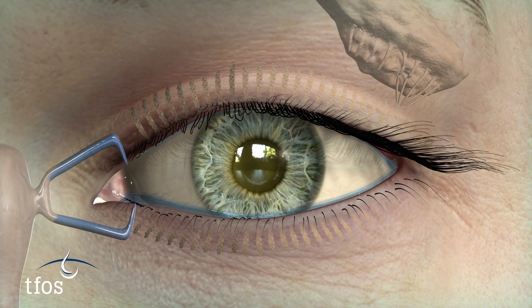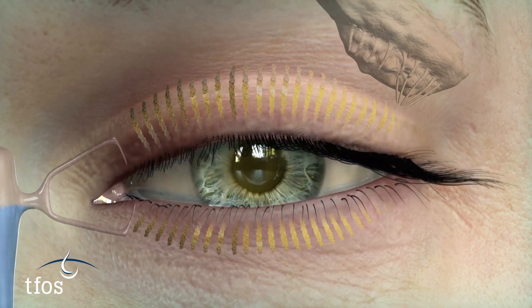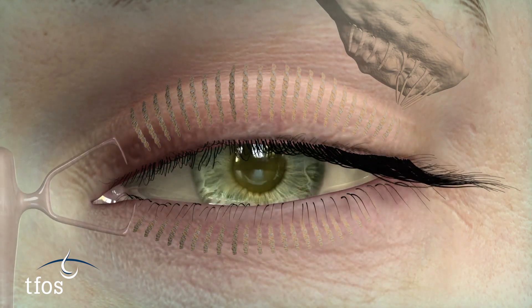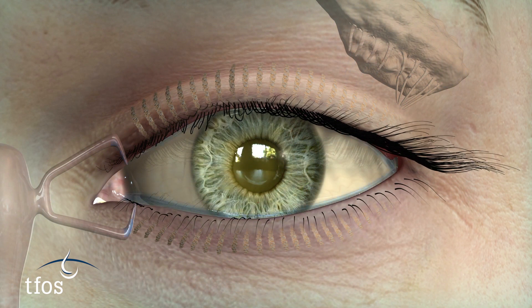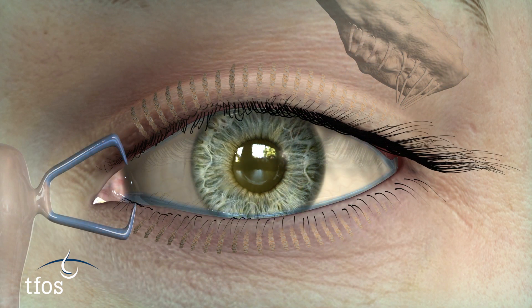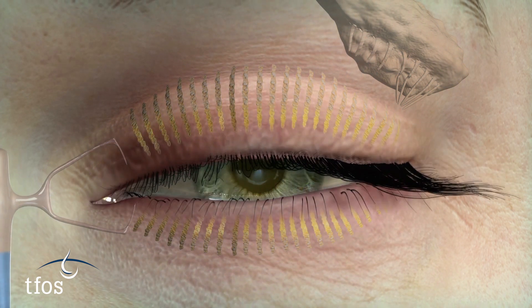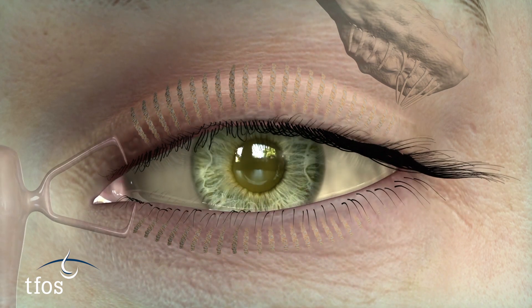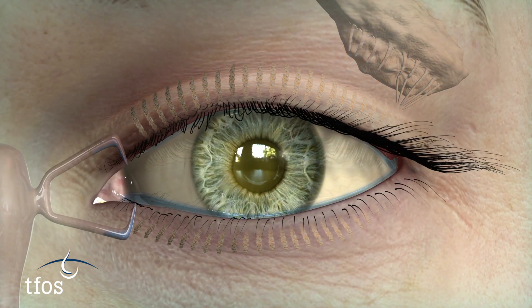The tear meniscus can be viewed non-invasively, so do not add fluorescein before performing this measurement. It is best to assess the meniscus height about two seconds after a blink, after the tears have stabilised but before break-up has occurred and triggered reflex tearing.